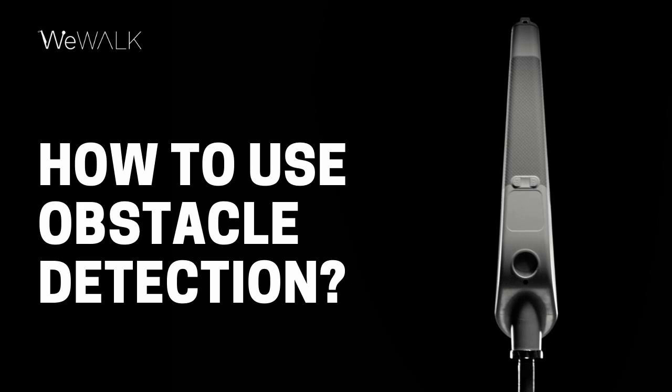When using obstacle detection, WeWalk will emit a continuous strong vibration if any obstacles are detected. Therefore, if you are walking down the street and you detect a vibration, you should swipe your cane left or right to detect where that obstacle is.